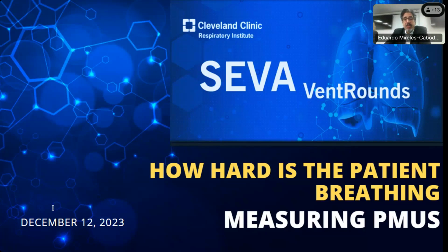Roberto, comments? Just quickly to say that in the adaptive pressure control modes, the ventilator reduces pressure, but it doesn't know the difference between increasing compliance and increasing effort, or both. It just knows it doesn't take as much pressure to deliver the target tidal volume.